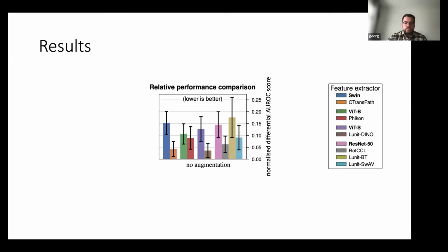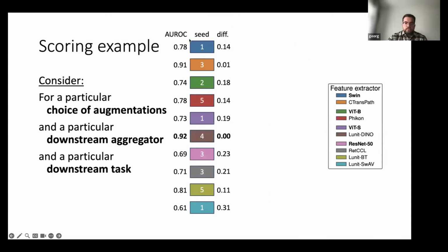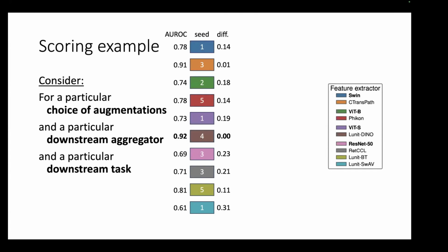Yeah, so in one particular configuration, you take the difference to the maximum value. But this is just one way of selecting a seed for every feature extractor. Why should we select a seed? So seeds are there just to show that there should be variability across different runs, and we shouldn't be using it, or at least not selecting it as a sort of pseudo hyperparameter of your experimental process. Or maybe I'm missing something.